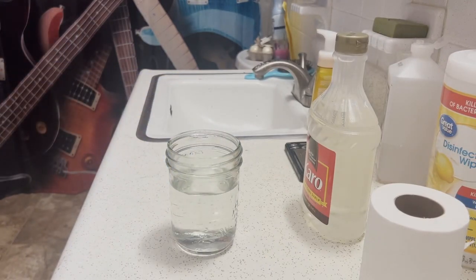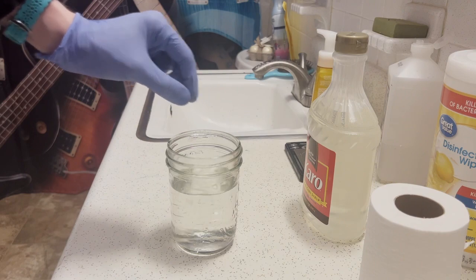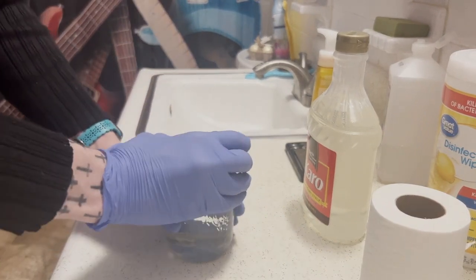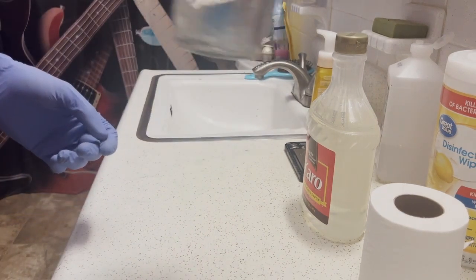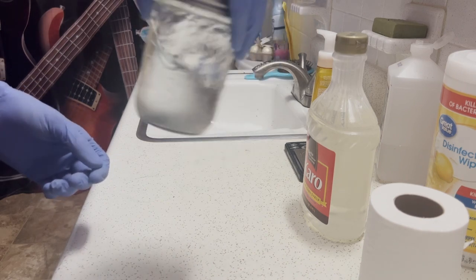Now I'm going to grab a rock, a pebble, a marble, or anything that's not inherently dirty — you're going to sterilize it anyway. I prefer to use small decorative rocks, which you can get at any crystal shop or even the dollar store. This is because you want to be able to stir around the mixture. The reason you want to do this before pressure sterilizing is that without stirring, most of the corn syrup will sit on the bottom and caramelize and harden at the high pressure-cooker temperatures.